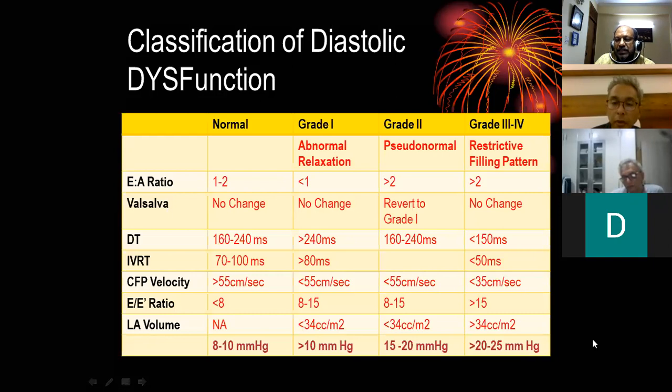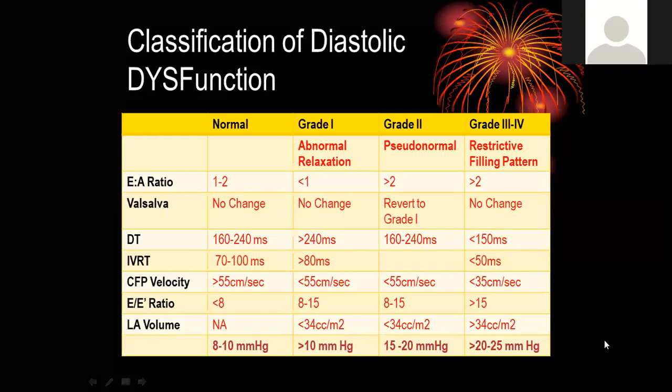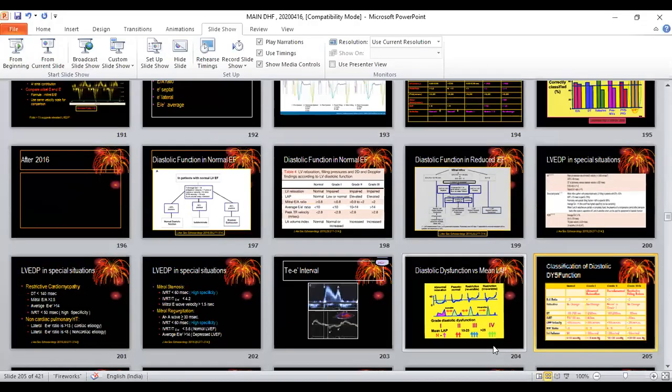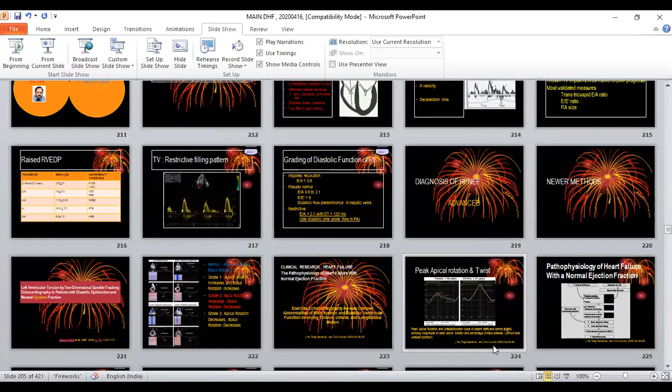So, the answer is, you have to use these parameters for calculations of LA pressures in all subjects, when talking about LA pressure evaluations. And that's what the answer is. I'll go to a couple of slides in the last.